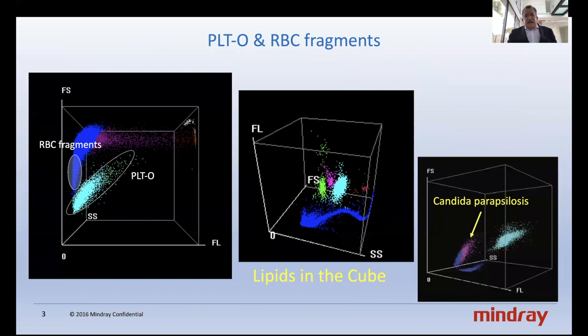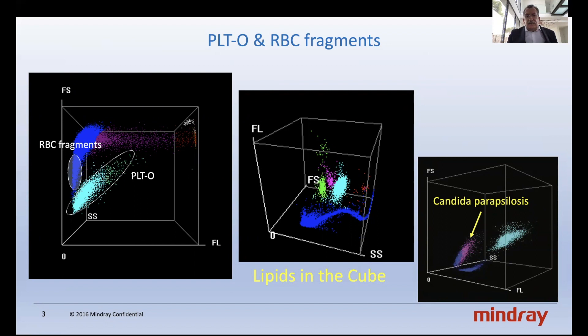Here we can see the histograms of optical platelets, showing how fragments and lipids can be differentiated using the Cube from other interferences. The presence of Candida also appears as an abnormal pattern of erythroblasts. If you train your lab technicians and have a poster with examples nearby the instrument, that will help to detect these interferences. When you use optical platelets, these particles — which don't have nucleic acids — are not counted as platelets.